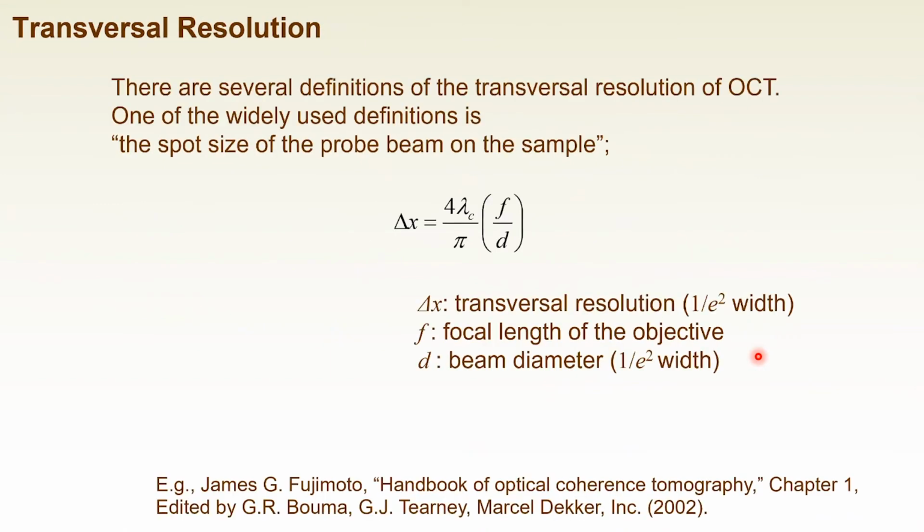Then I just gave a brief summary of the depth resolution of the OCT, and then I also would like to give a very short introduction and a very brief idea of the transversal resolution of the OCT. Okay, but before talking about it, I would like to clarify that transversal resolution of OCT is still very controversial. And even OCT people were not paying that much attention to the transversal resolution so far. And also, it pretty much depends on the system configuration. But there is one widely accepted, it's not an estimate, but a measure of the transversal resolution.